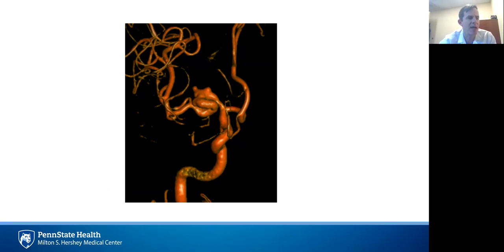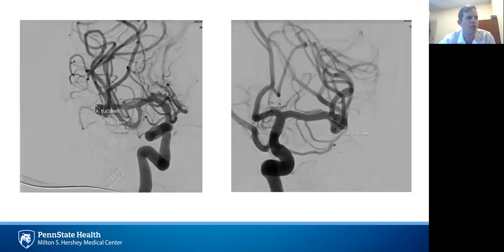A few points make MCA aneurysms challenging for flow diversion. First, many MCA aneurysms such as these occur at the bifurcation, often making surgical management or traditional coiling more straightforward than flow diversion. Consequently, flow diversion is more often used in the MCA in cases of non-bifurcation aneurysms, such as in this case, giant partially thrombosed aneurysms, blister aneurysms, or recurrent aneurysms.